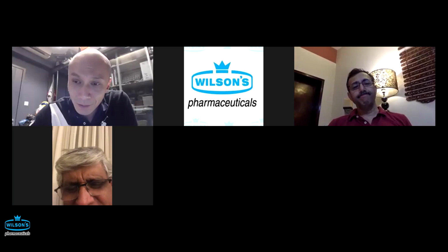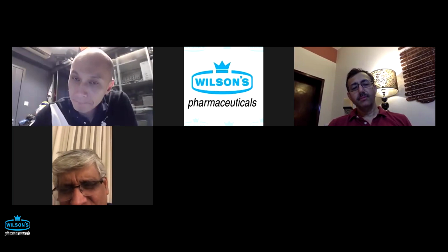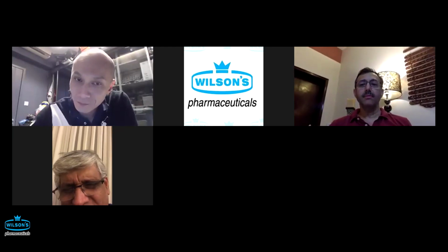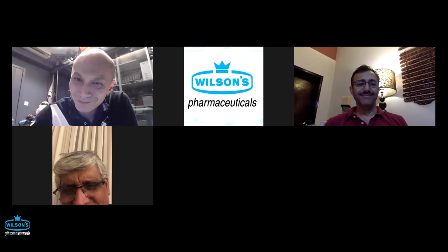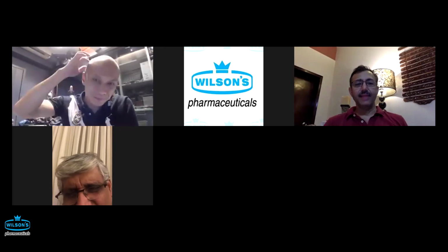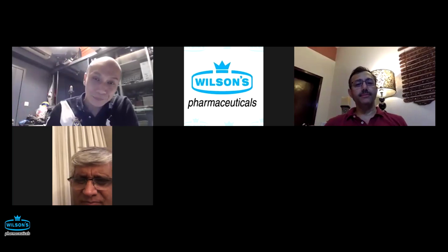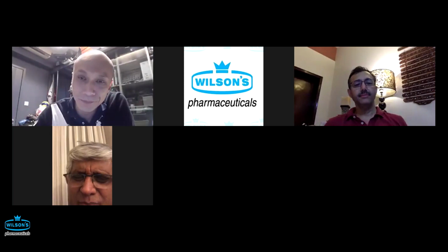For prophylaxis, I think we have to be strong on this one. We should avoid using straight stents, because I've seen migration causing havoc for someone that you are trying to prevent pancreatitis in, ending up having chronic pancreatitis because of stent damage and injury. I think straight stents must, if possible, be avoided at all costs. I don't know what you feel, Andy. Definitely. We are using mostly single pigtail.